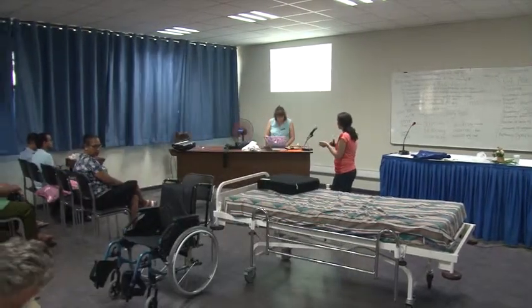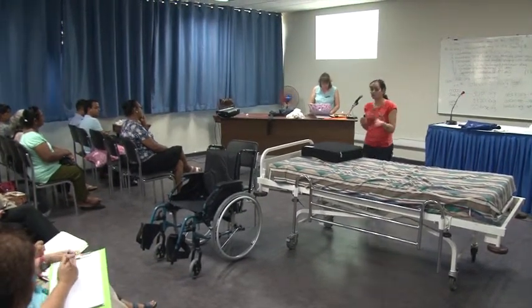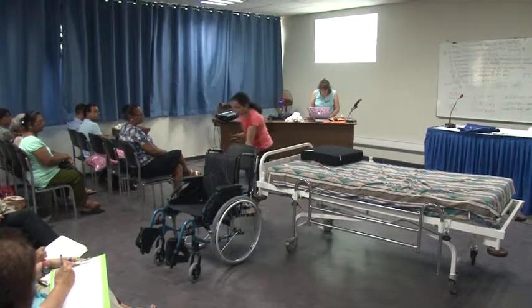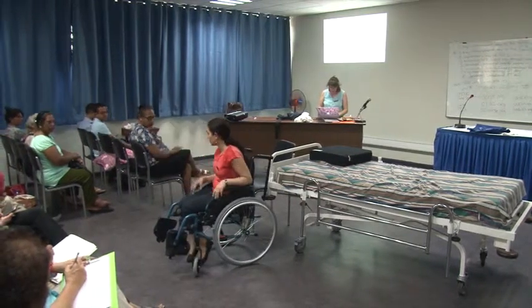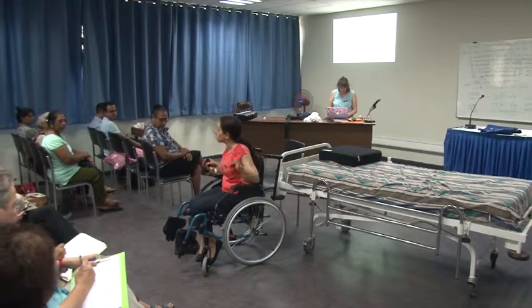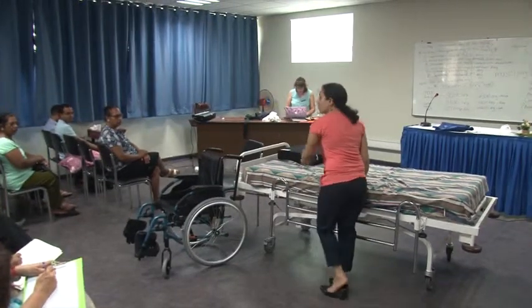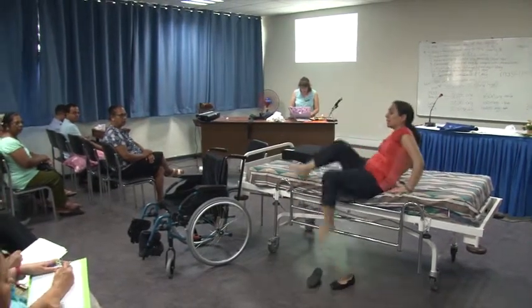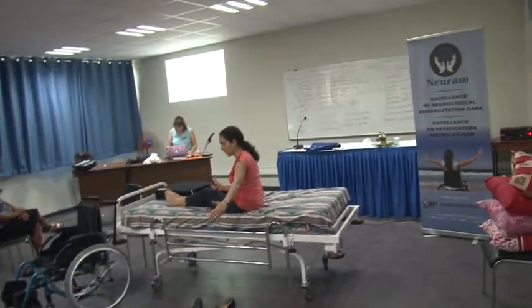So basic types of transfers that we teach and we come across are short sitting transfer, which means legs down. So transferring, I'll be in the chair to explain, legs down, that's what it means. Okay? Long sitting transfer is something we will demonstrate. What it means is that you're transferring the person from whichever surface, and he's sitting with legs up. So from here as well, in this position as well, you can transfer the person on the wheelchair if they are not able to bend their legs. Okay? Or there are other reasons as well. So this is called legs up transfer or long sitting transfer.